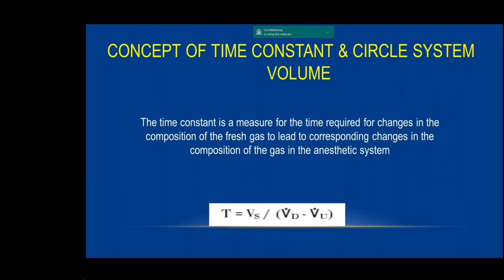Now let's come to the concept of time constant. This is a concept which is very important to understand how we induce a particular patient on inhalation anesthetic agent, as well as whenever we make any changes in the dial, how much time it will take to reflect in the patient's system and ultimately the lungs as well as the brain.